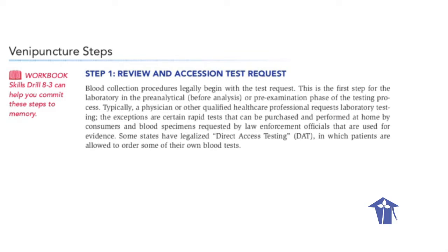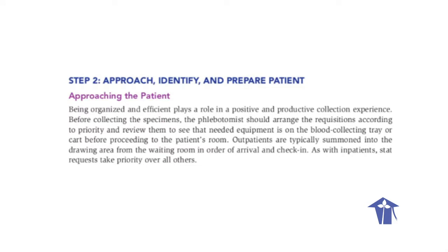The test requisition. The form on which test orders are entered is called a requisition. The requisitions become part of a patient's medical record and require specific information to ensure that the right patient is tested, the physician's orders are met, the correct tests are performed at the proper time under the required conditions, and the patient is billed properly. Step 2, approach, identify, and prepare patient.